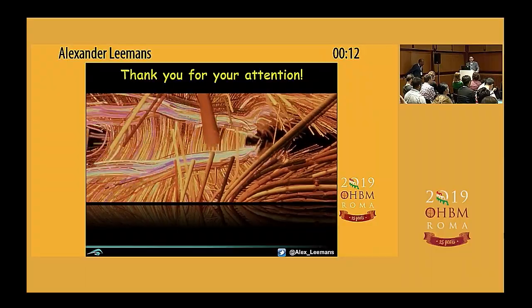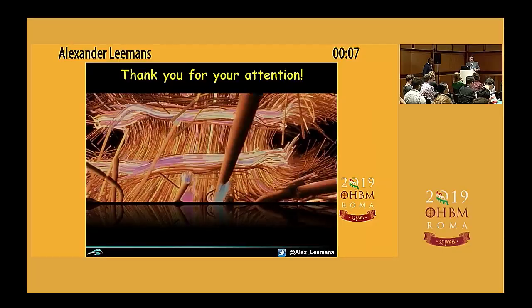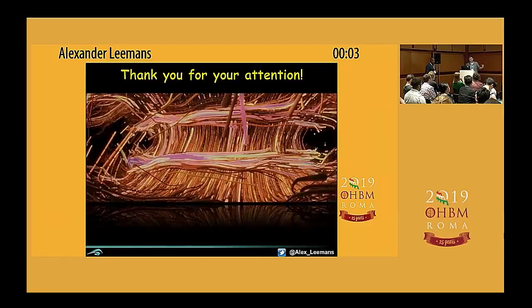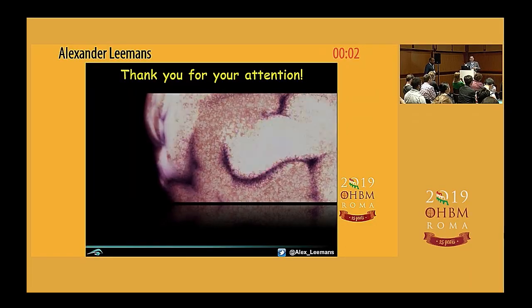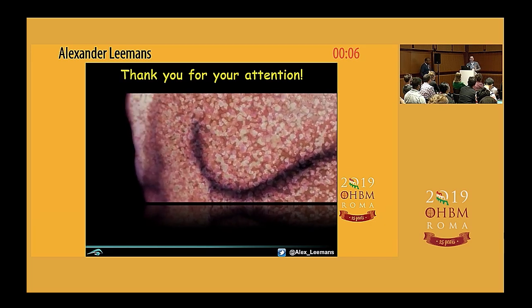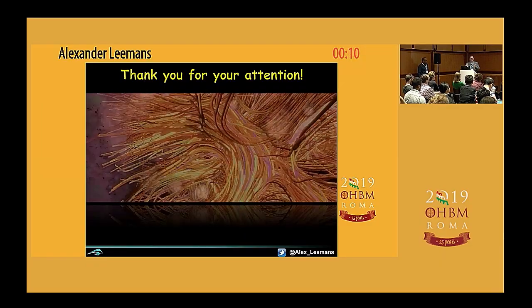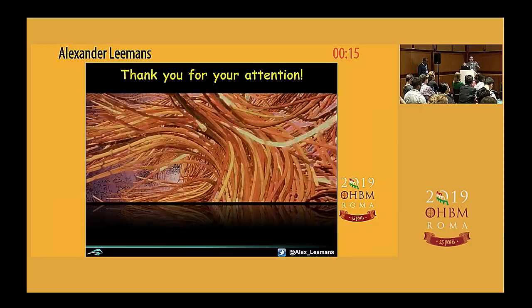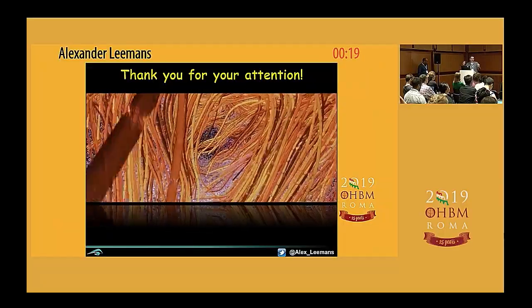And then obviously this is purely from a QA point of view, the topic of this session. But if you want to do analysis, sometimes you can further optimize your pre-processing in the context of your analysis. For example, go to some template space while doing correction for subject motion, because you don't want to resample your data again and again, because you get smoothing effects. Ideally you want to concatenate all these transformation matrices together to go into one final space.